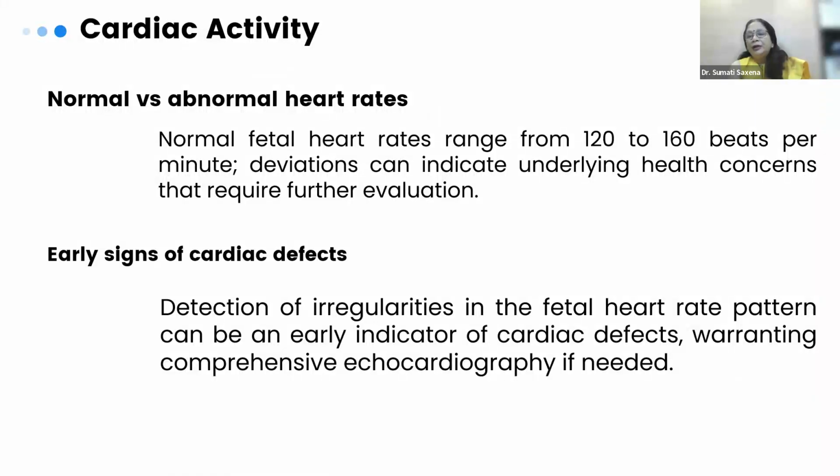In trisomy 13, trisomy 21, and Turner syndrome, there is fetal tachycardia. In cases of trisomy 18 and triploidy, there is fetal bradycardia. So you can differentiate between the trisomies in the case of first trimester screening also.